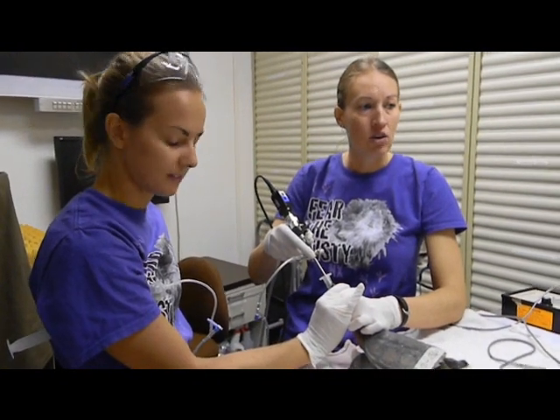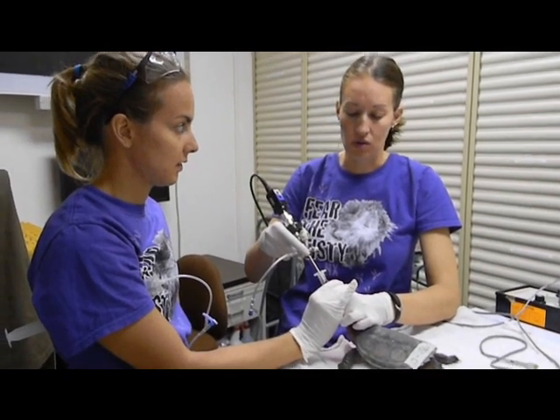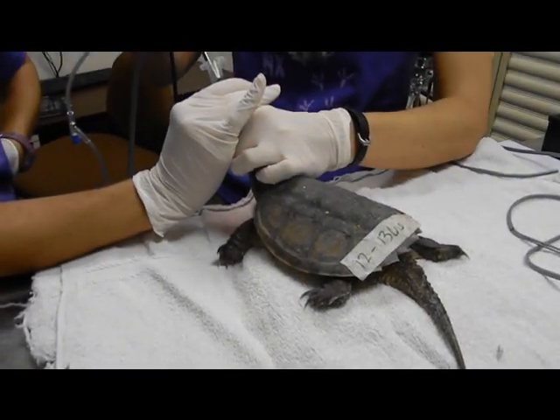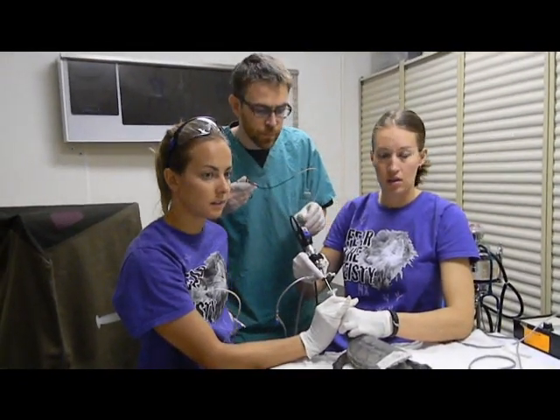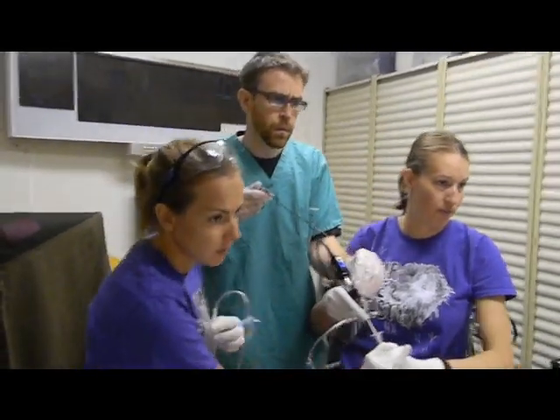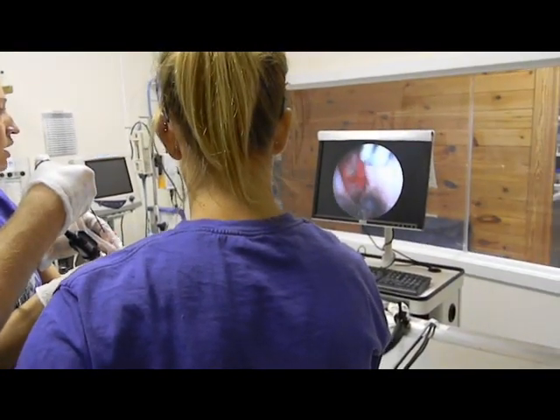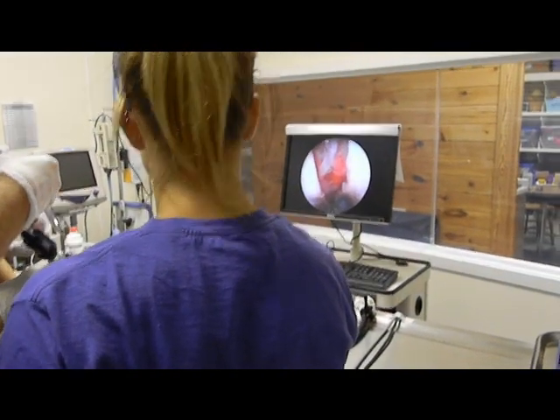I kind of think — because I don't want to continually keep sedating him — perfect, that's beautiful. And don't want to forget, maybe actually right now while we're doing this, once you have the instrument in, Rich, before it comes all the way out, pull it back up a little bit — will you take a picture for me, just hit the number one button? Perfect.